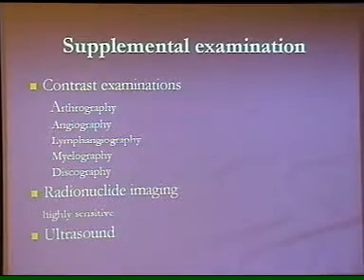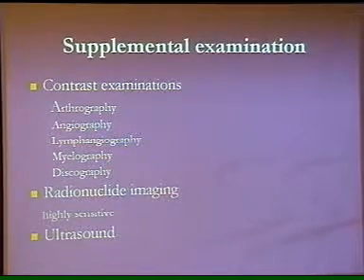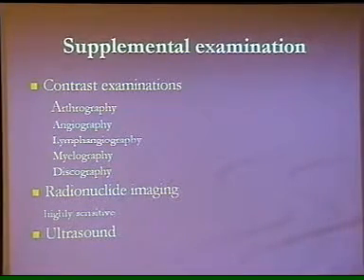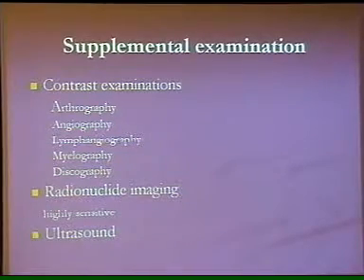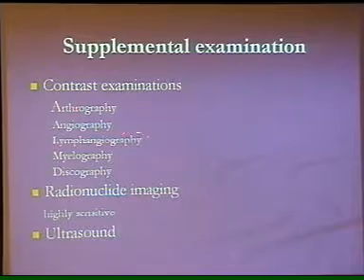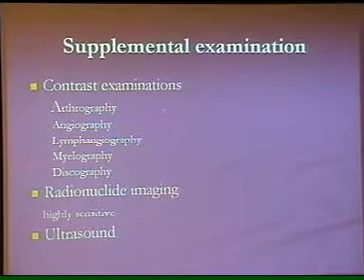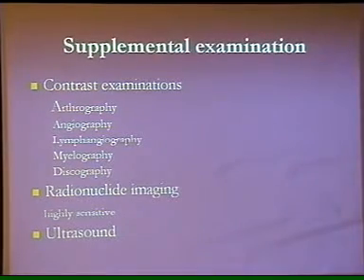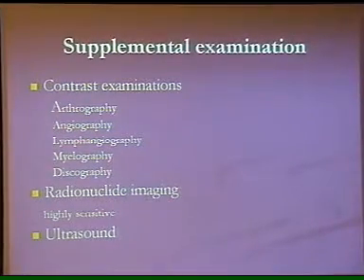X-ray of the area of interest is one examination, but sometimes you have to have other modalities and other techniques to finalize the pathology. Number 1, you can do the contrast examination like arthrography, angiography, lymphangiography, myelography, discography, depending upon the area of interest and the most appropriate investigation which is required to diagnose that.